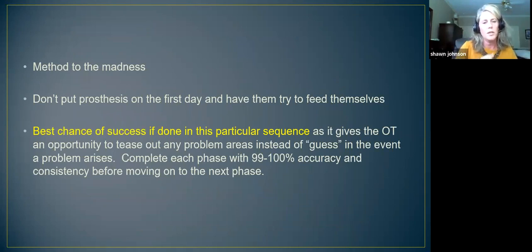We do not want them to put the prosthesis on the first day and try to feed themselves. It will just frustrate them and get them not motivated to want to try and practice. I have found over the past, oh my gosh, 15, 20 years that the best chance of success for incorporating a prosthesis into your daily life is if it's done in this particular sequence. It gives the OT an opportunity, or the prosthetist an opportunity, to tease out any problem areas instead of guessing what could be the problem.